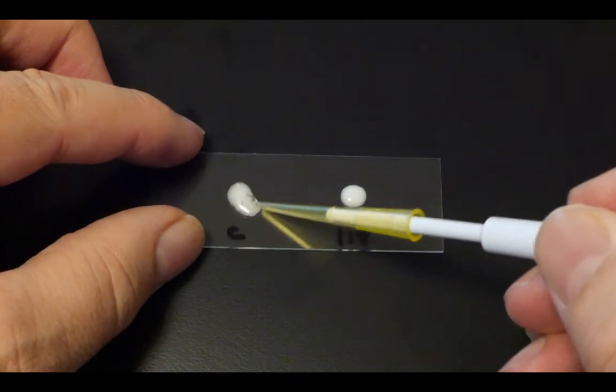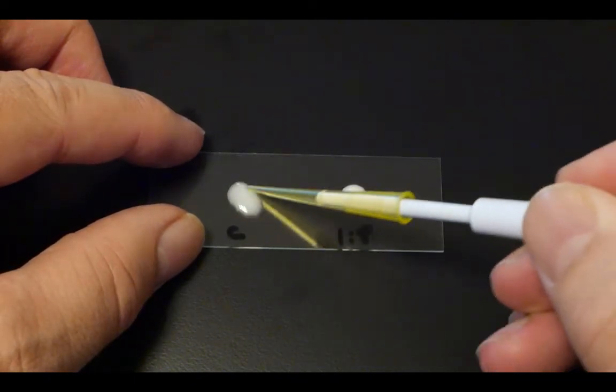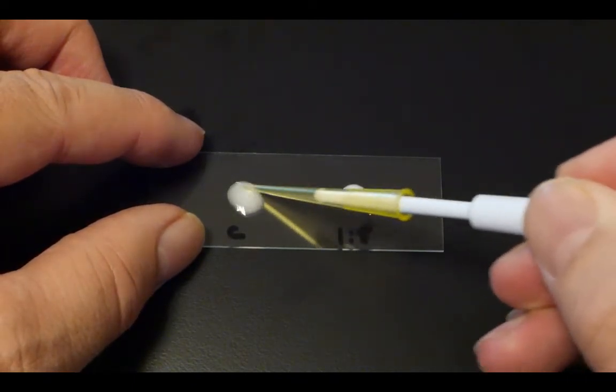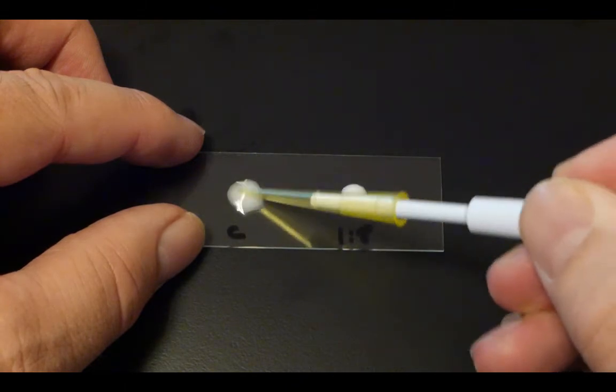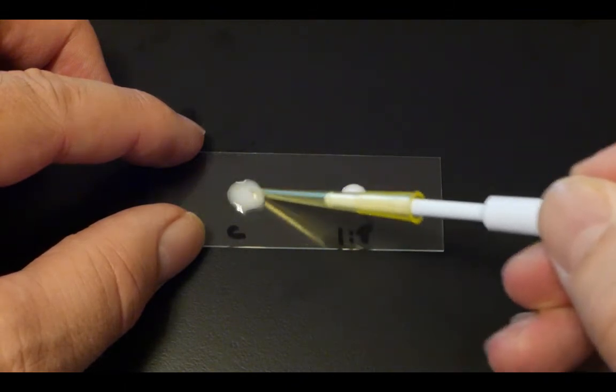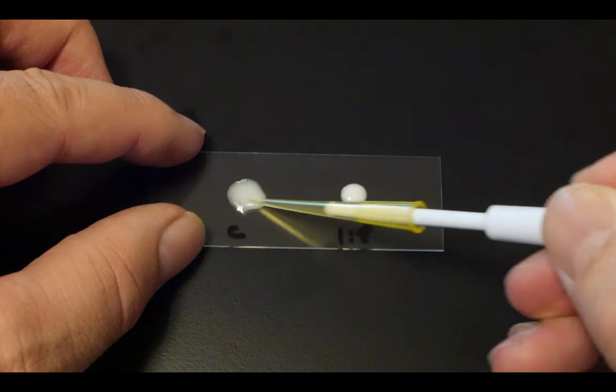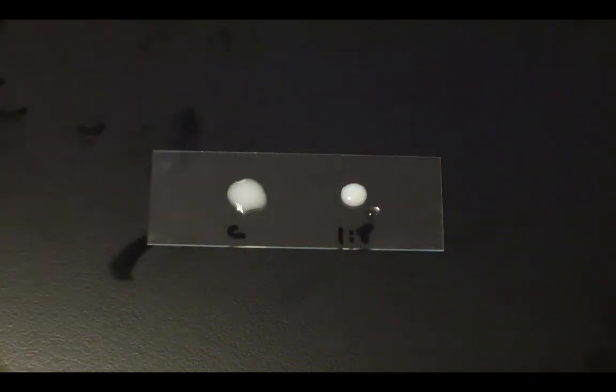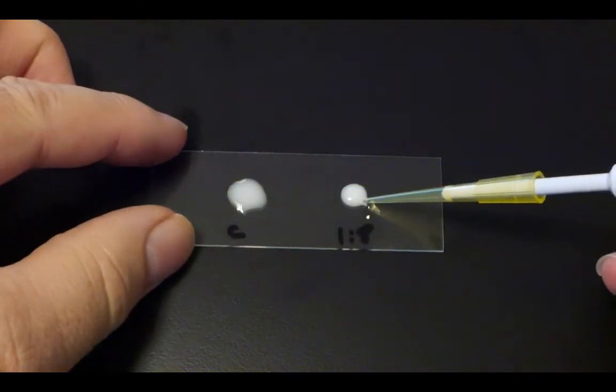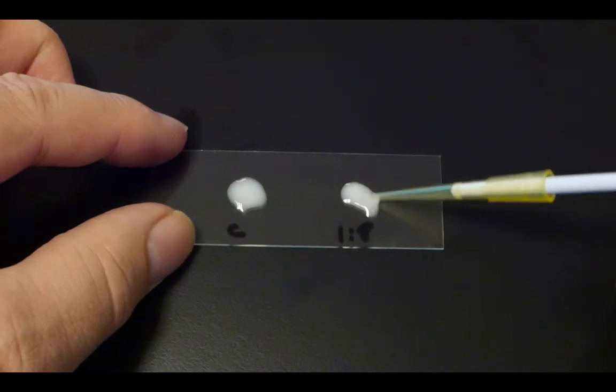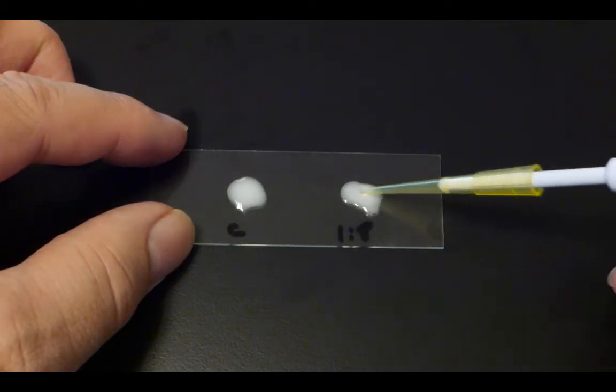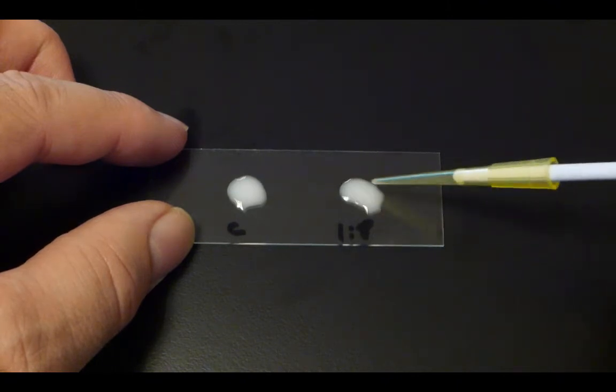Next using a clean pipette tip mix the latex beads with the sample. Make sure everything's thoroughly mixed, change tips and then mix the next sample with the beads. Try not to spread the drop out too much. Again make sure the sample is thoroughly mixed.